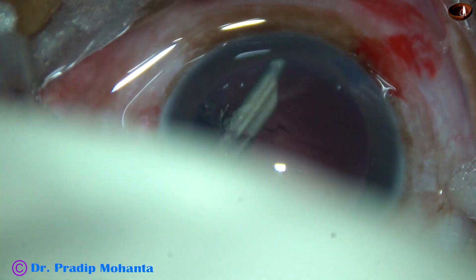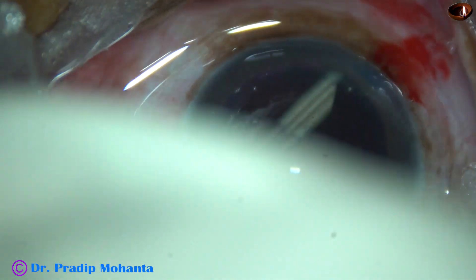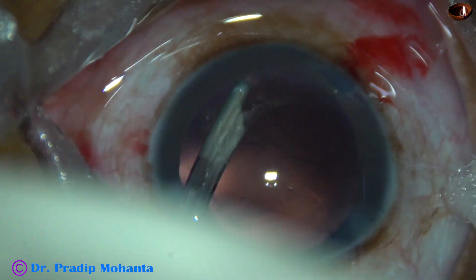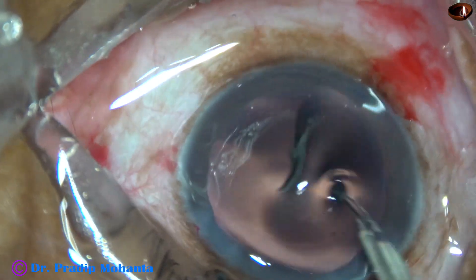So we are towards the end of the cortical cleanup. This is the last portion of the cortex, and it is done.